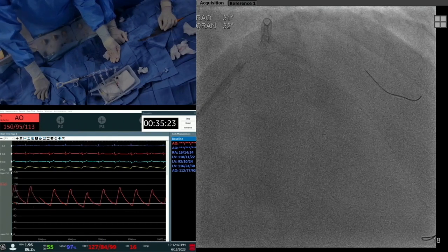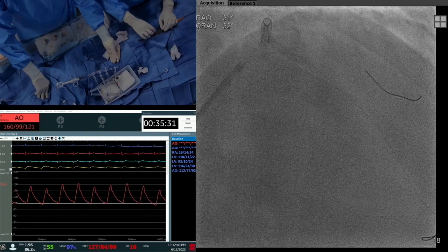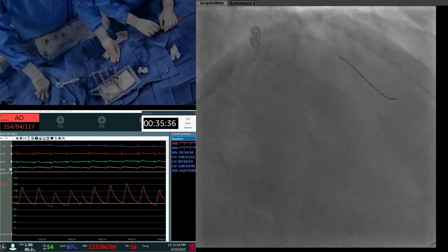DK crush actually has made it to the guidelines now. So yes, if everybody out there says I want to go DK crush, yes, okay, good. Nothing wrong in that. All right. So take us through your technique here.